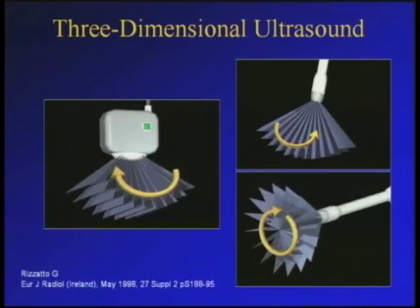By using automatic transducers, it's not necessary to move the transducer over the surface. You can place the transducer over the organ or the area that you want to assess, and then the transducer automatically, by using electromechanical components, will make the three-dimensional acquisition.